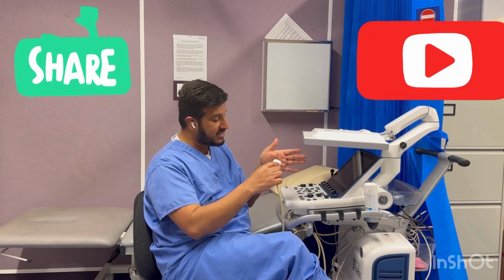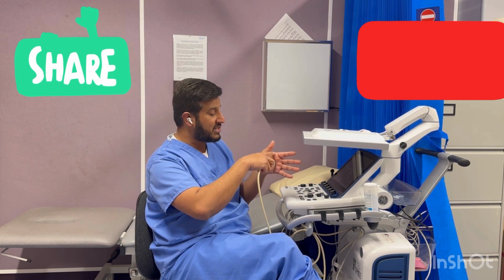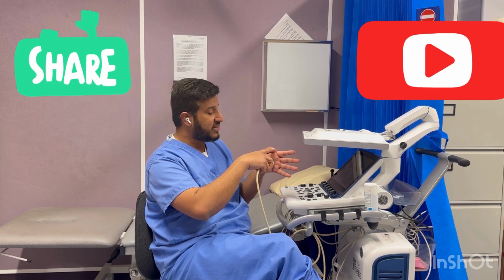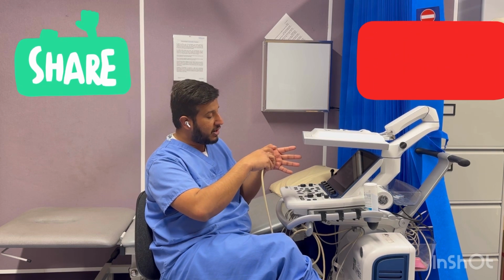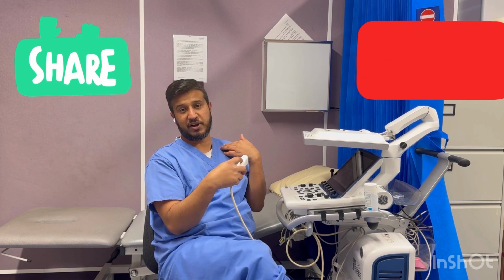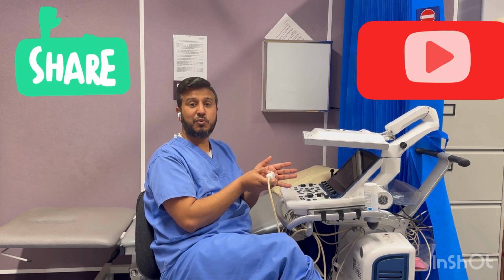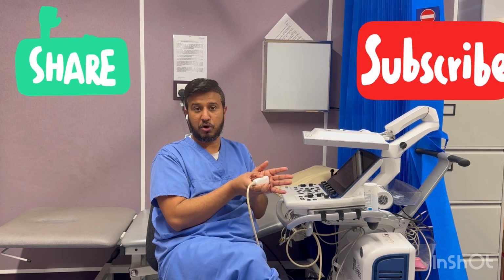Then for the short axis, your probe was here. Short axis means vertical views. So you will move your probe towards the vertical. For example, this one is the face of the patient. So this marker will go either to the face or towards the left shoulder of the patient. Like your marker will be at 90 degrees, at 12 o'clock, okay?